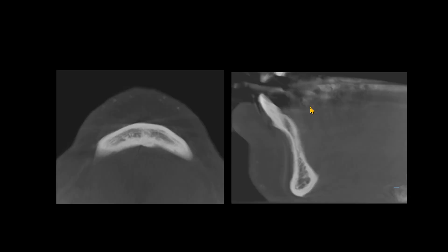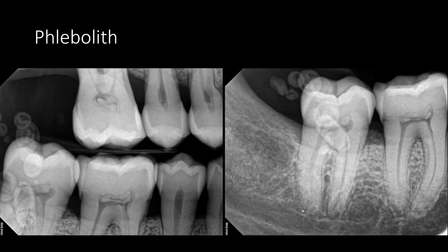Let's review examples of osteoma cutis in CBCT scans. Osteoma cutis can be very faint. The left image is an axial view at the level of the mandibular symphysis. The right image is a sagittal view at the midline of the mandible. You can appreciate that these ossifications are very superficial at the level of the skin.